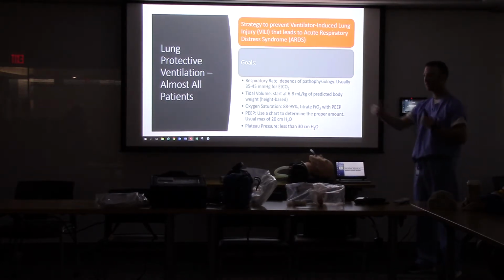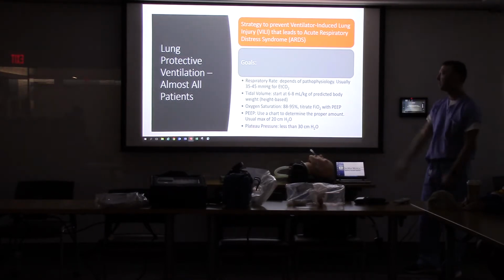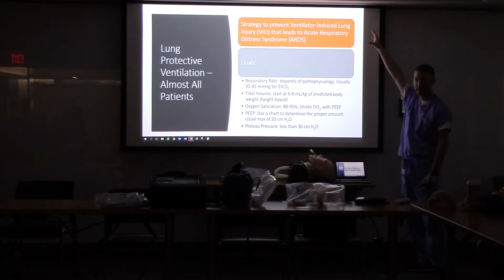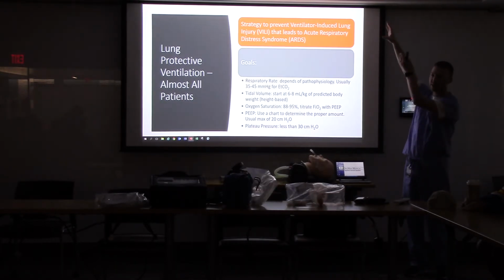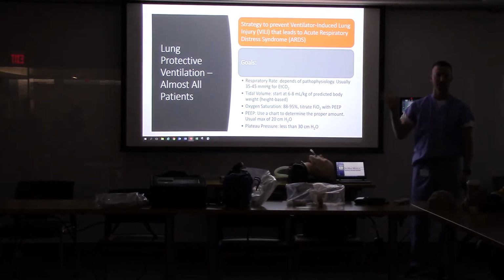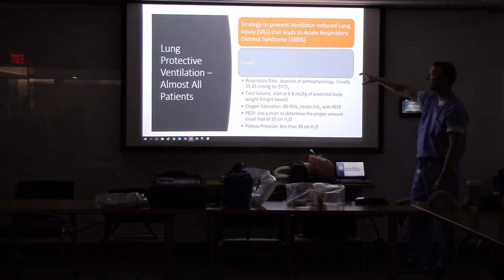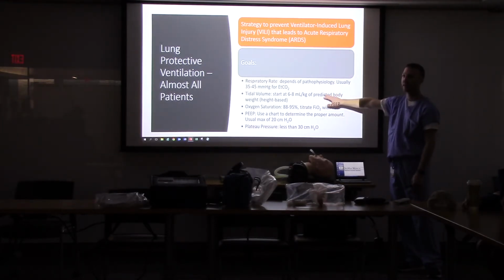So you stent the lungs open with PEEP, but then you just deliver smaller breaths in between. That started in the ICU, and then as hospitals became overcrowded and patients destined for the ICU never got up there, we started moving the ventilation strategy down to the emergency department and said, okay, as soon as you intubate the person, either before or after they have ARDS, start them on this ventilation strategy.